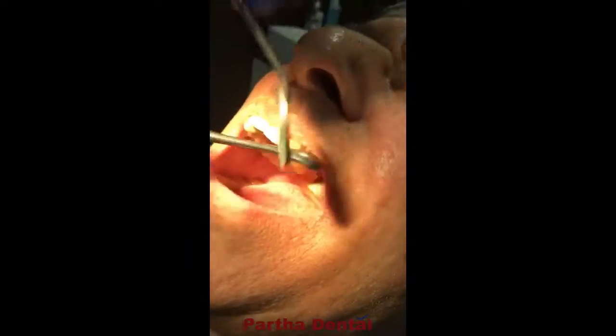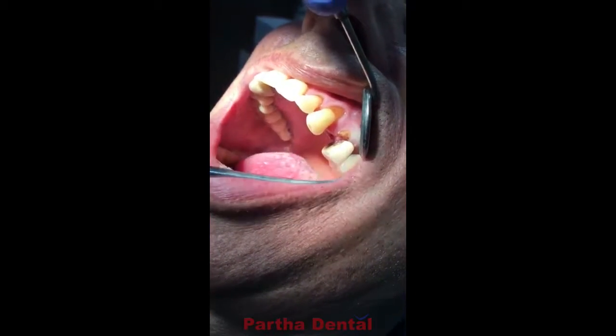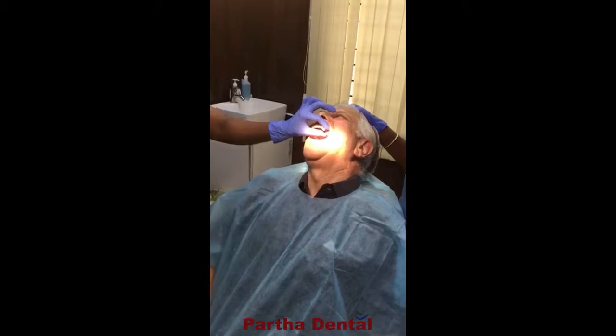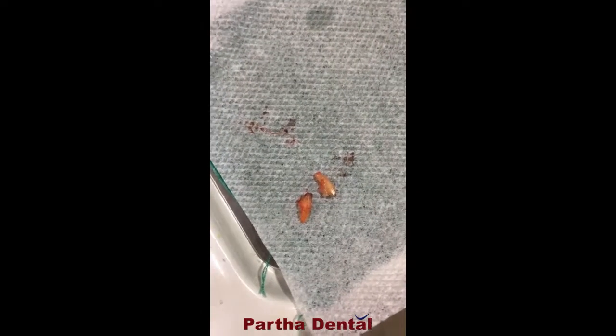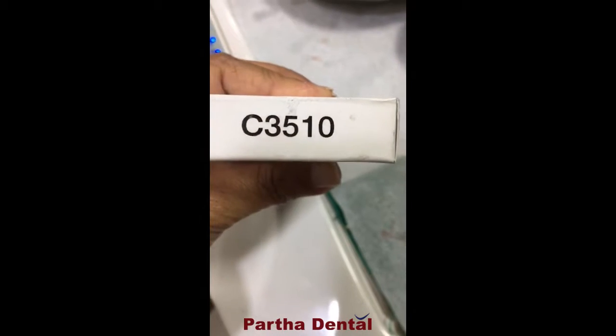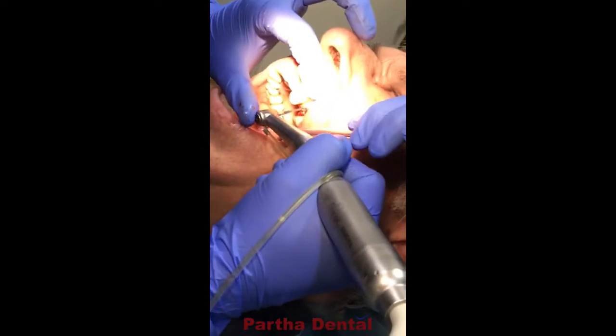This is the root stump which we will be removing and placing an implant, then giving a tooth. This is the root piece after extraction. Measuring the length and the width of the root piece, we decided to go ahead with a 3.5 mm width and 10 mm length implant. Immediately after the implant placement, we could deliver the crown to the patient, and the patient was extremely happy because we replaced his missing tooth on the same day.